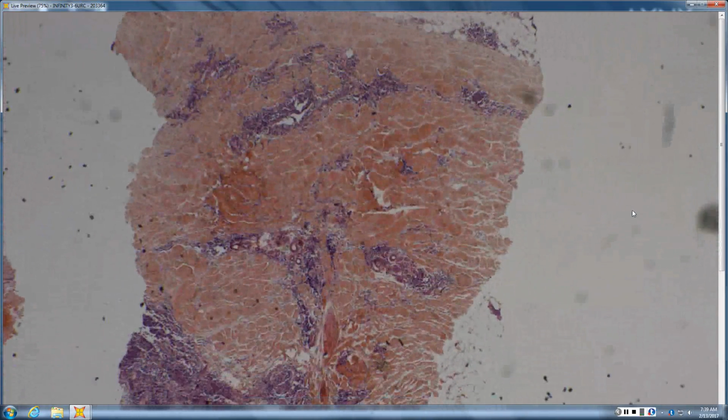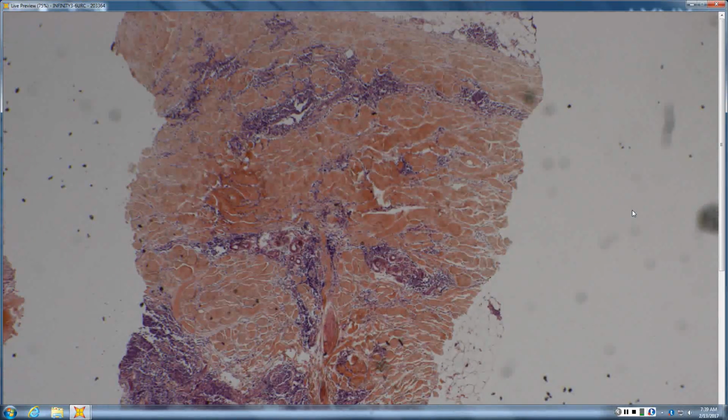It's very sclerotic in the deeper dermis. Very sclerotic, hyalinized, loss of space between collagen bundles, some loss of periadnexal fat, nodular lymphoid or lymphoplasmacytic infiltrates. So what are we looking at? So like scleroderma. Yeah, morphea. So inflammatory morphea. Very good.